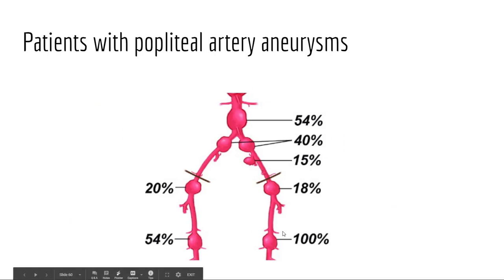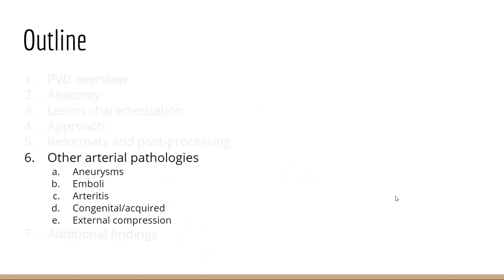If you note a popliteal arterial aneurysm, half of those patients will have a contralateral popliteal artery aneurysm, and also half of those patients could have an abdominal aortic aneurysm. Other common sites are the common iliac and internal iliac arteries. For some reason, we just don't often see the external iliac arteries demonstrating aneurysms. Don't know why. That's a good idea for the researchers.